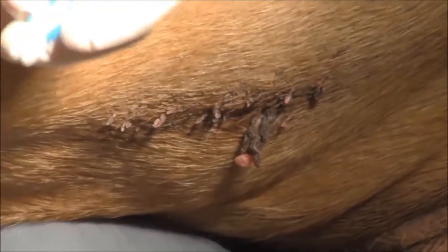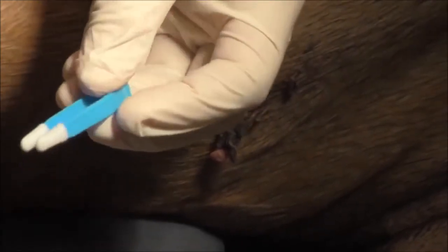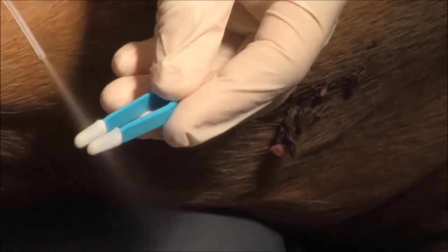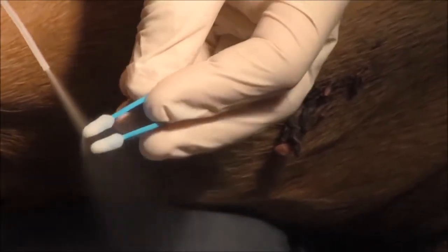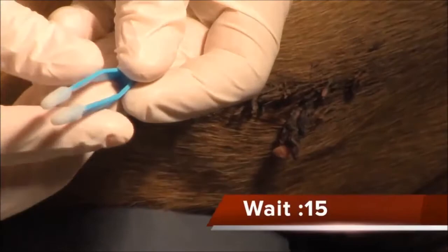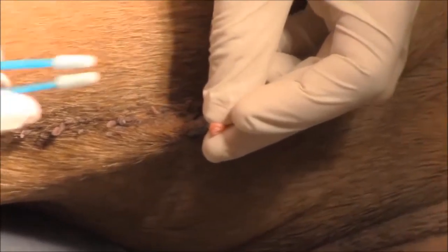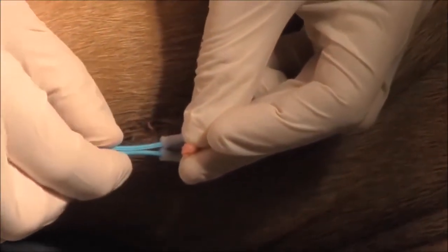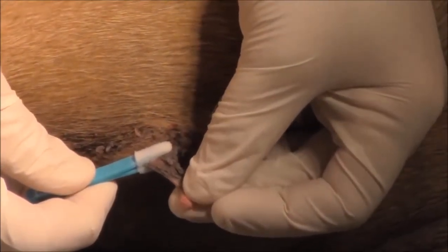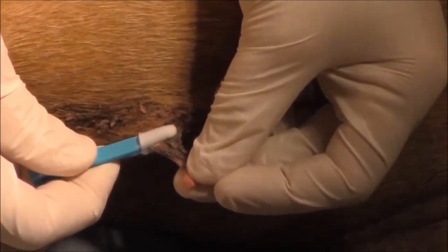What we're going to do is take the Cool Renewal and spray it on this little applicator — it's like some tweezers. We're going to spray it and make these tips really cold. We'll spray it good for this demonstration, then let it sit for about 15 seconds. Then I'm going to pick the skin tag up and press this on the skin tag, hold it right there — and you can see Angus is not even moving.